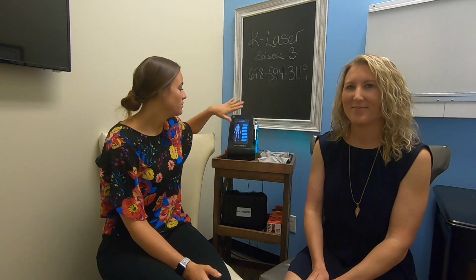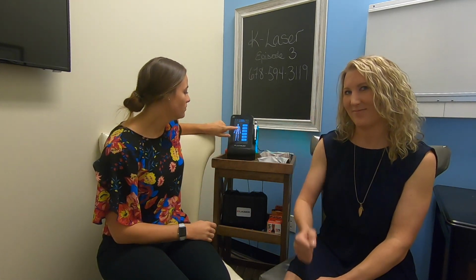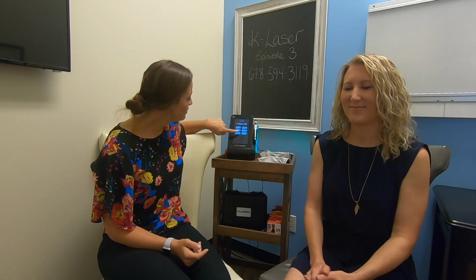So as you can see, we have our first screen, just simply going to hit new treatment. From here, we see our body. You can choose what part of the body we're going to work on. Like we said earlier, we're going to do Dr. Christina's wrist today. So, upper extremity is our next choice. Here you see all the things: shoulder, arm, elbow, forearm, wrist, hand. Like I said, it's the wrist.